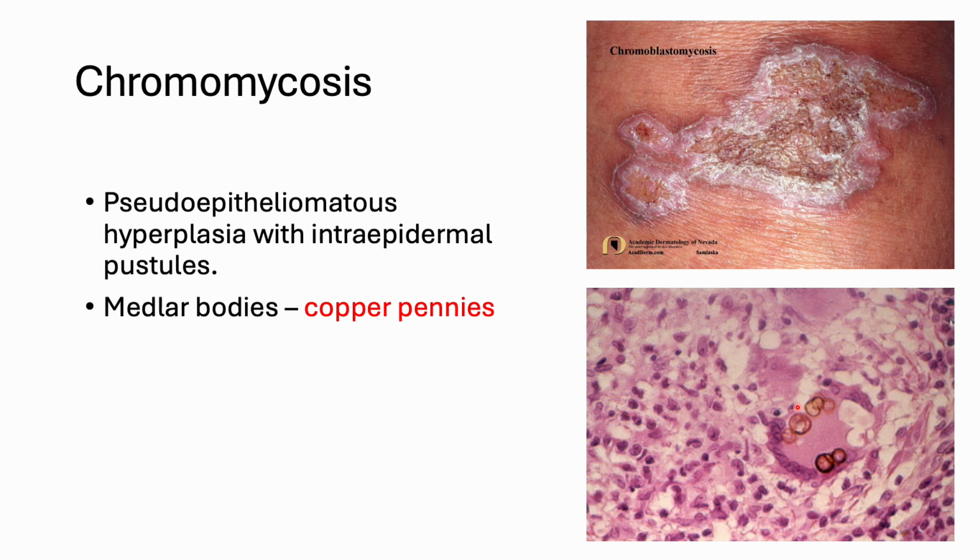And this is another one that can have very significant pseudoepitheliomatous hyperplasia, with pustules. So pay attention to the deep portion, especially in the granulomatous area. You may find some organisms. Do not call squamous cell carcinoma in your board exam. That's almost always the wrong answer.